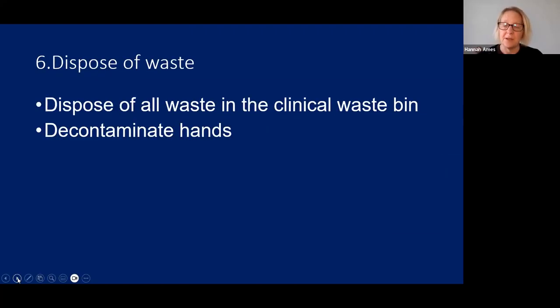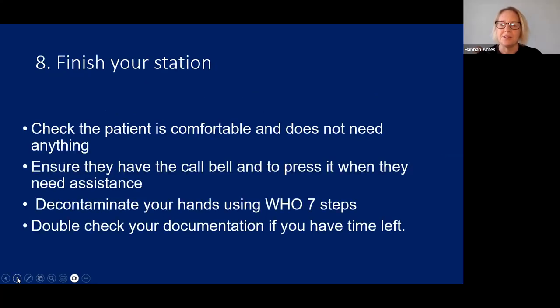If we haven't disposed of any waste, obviously go back and do it then. Remember, if you're tight on time, always prioritise that documentation, and you can verbalise your waste apart from your sharps, which you must put into the sharps bin. Obviously, decontaminate your hands and finish your station. You can just check the patient is comfortable, doesn't need anything, and that they've got the call bell and know when to call you. If they need any assistance or are having any adverse reactions, you can say that you'll come back and check them within the next 30 minutes. And then if you've got any time left, always double check your documentation.